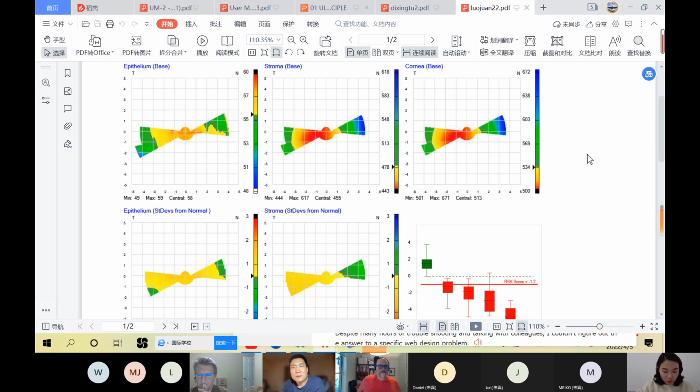We tried to scan it, but it just focuses the red line on the cornea. But if we focus on the cornea, and we can't see other parts, so it can work, but can't work well.